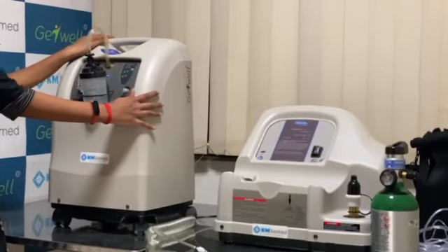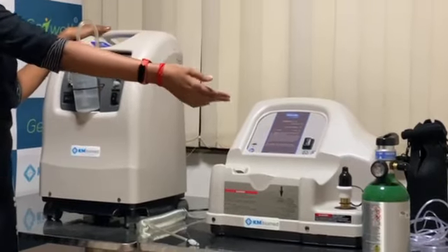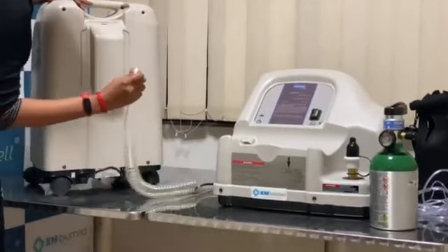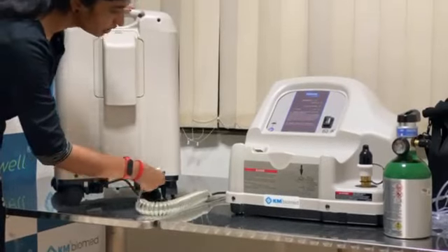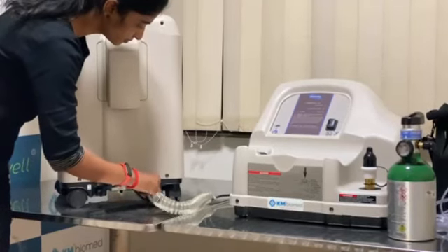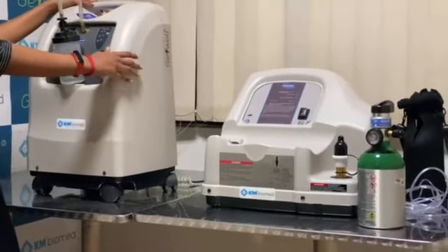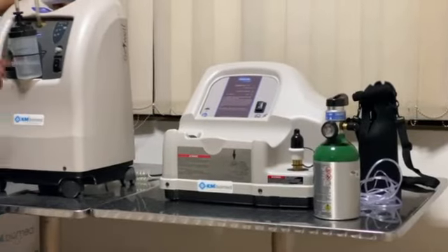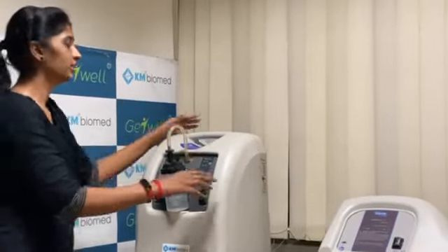Today I am going to talk about how to fill oxygen into this home fill system and how to fill it to the cylinder. To do that, we need to connect this coil to the port. We have an outlet and there is a compatible inlet. Once we connect it, the oxygen will be transferred through this coil to the system. The patient can also inhale oxygen simultaneously while we fill the cylinder at the same time.